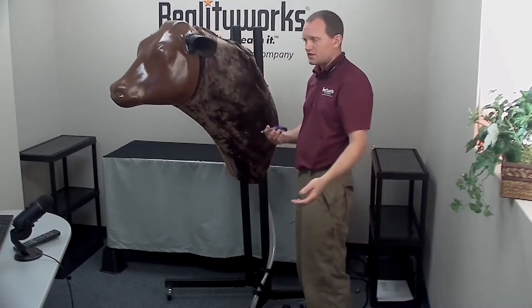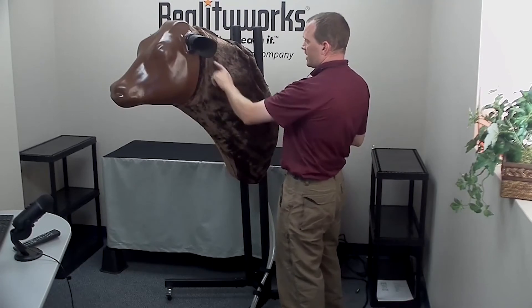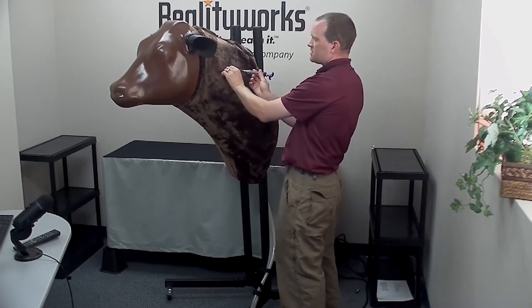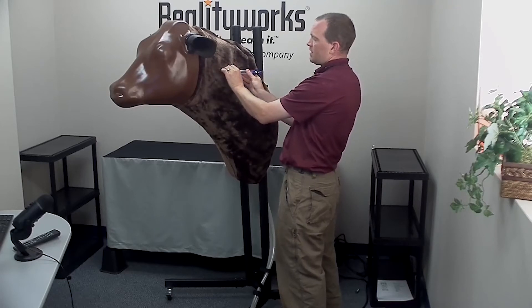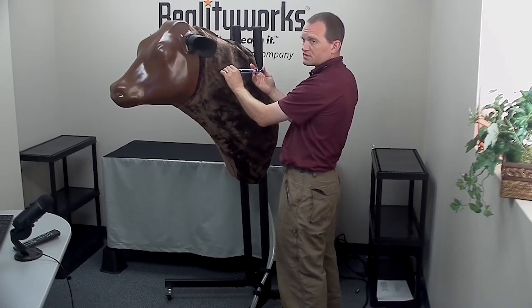For subcutaneous injection, imagine that same area, tent the skin carefully with the needle, inject, and then you can dispense the product into the simulator.